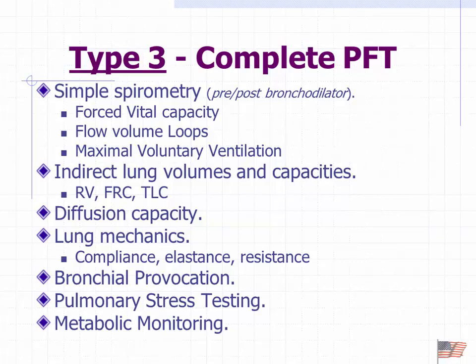And we're looking for, in you and I, assuming you and I don't have asthma, we wouldn't see a response. In these folks, we would end up seeing a response, for which we can treat immediately with a short-acting beta agonist, like albuterol. It can be a medication, and we can also do it with exercise. Some folks who have exercise-induced asthma, just the fact of putting them on a treadmill and having them run, we can induce an asthmatic attack for the same exact reason.